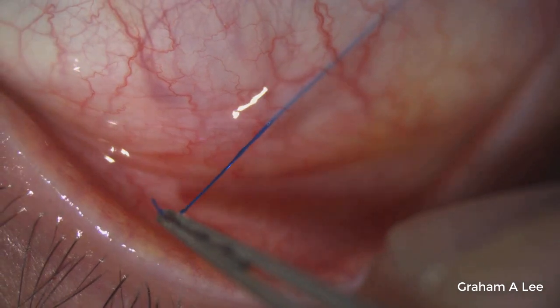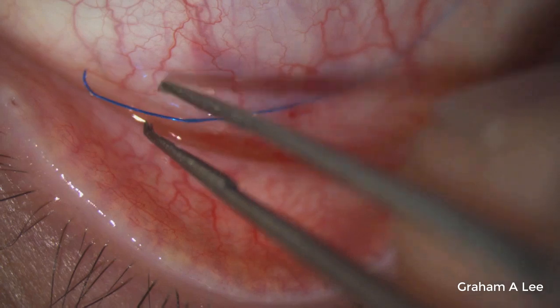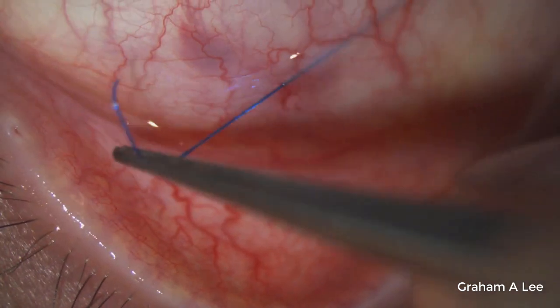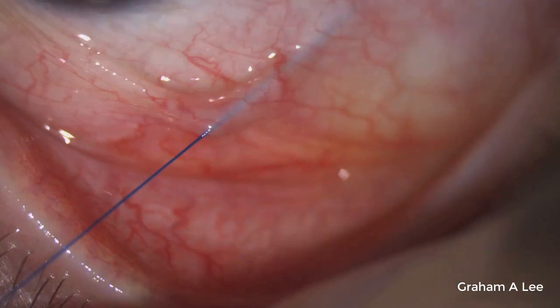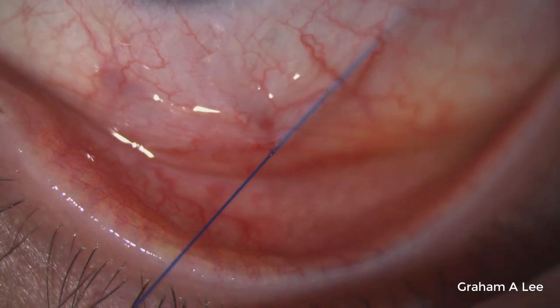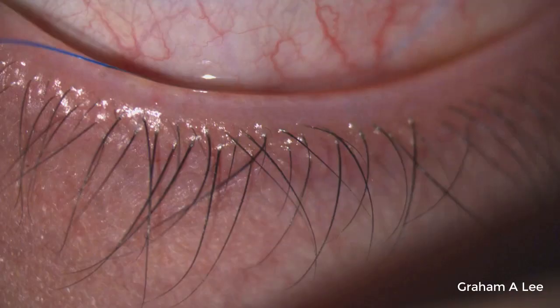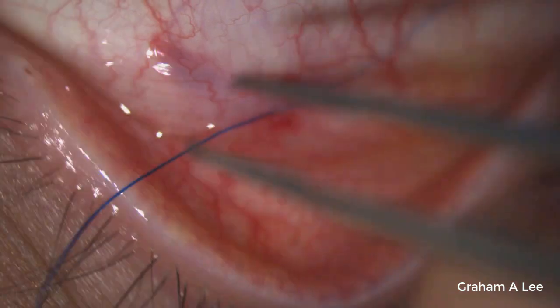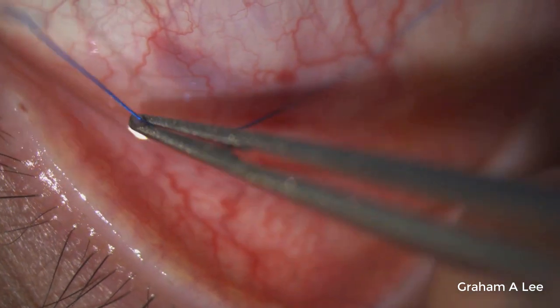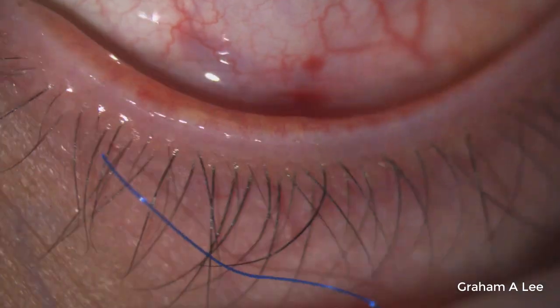He's a young fellow, history of uveitis. So, it does take a little bit of pulling because there's a bit of fibrosis around that Prolene. But the thing about Prolene is it's quite strong. It's stronger than the 3-0 Supramid. So it's actually okay to get out even at 18 months and probably longer than that. So that's removing that Prolene.